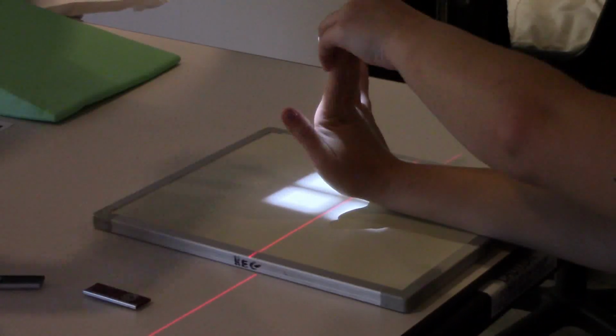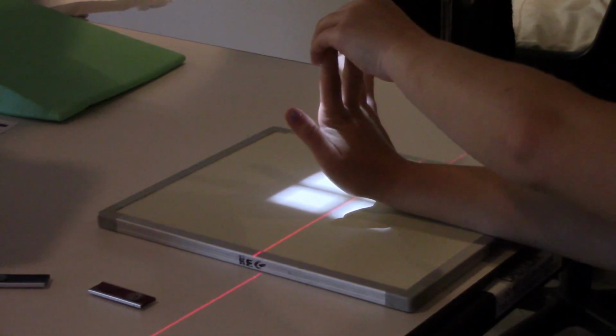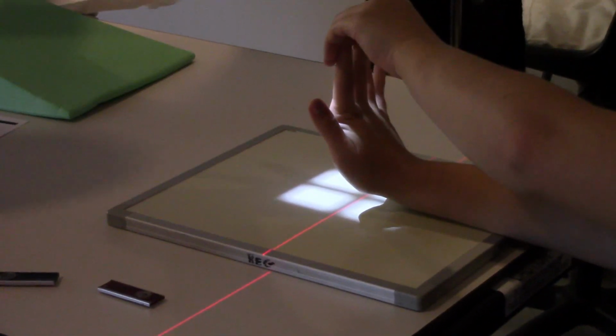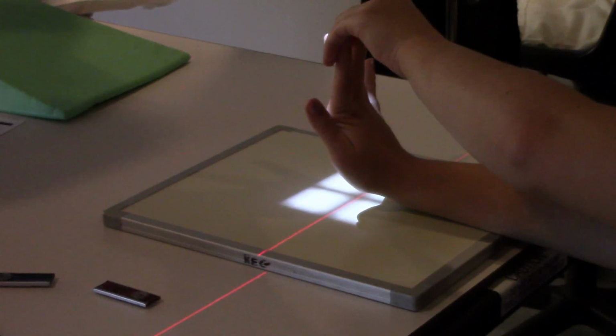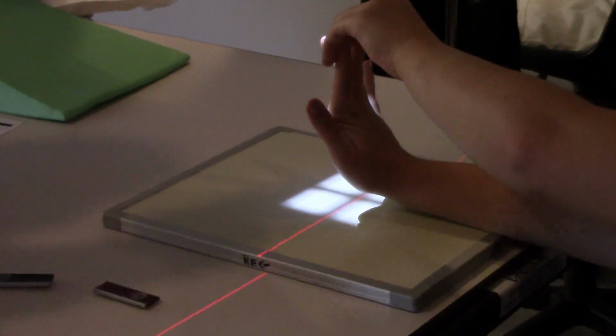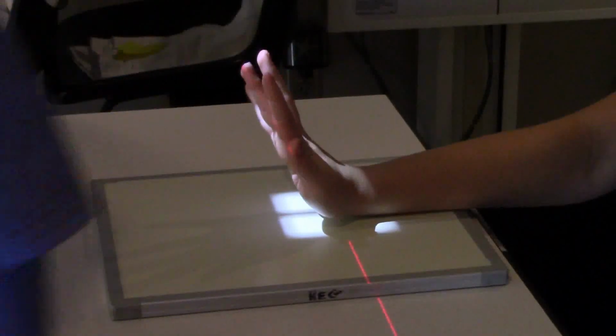Okay, Gaynor-Hart view of the carpal tunnel. How's that look? I'm not sure.